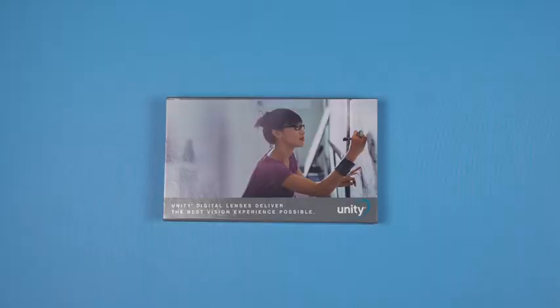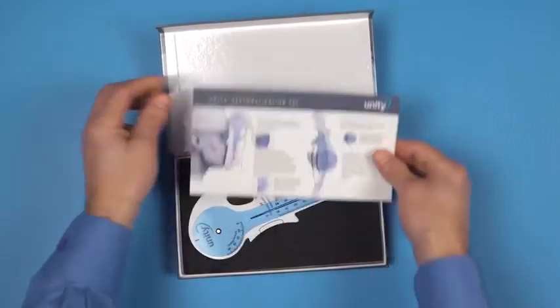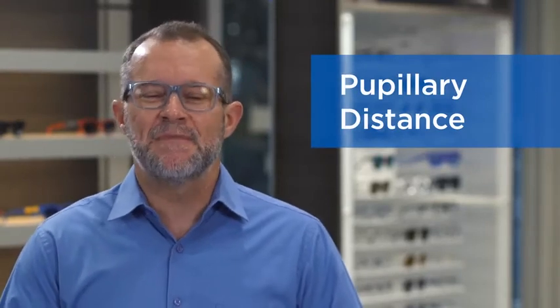Hi, we're here today to talk to you about how to use your Unity Personalization Key. This easy-to-use tool is what you'll use to take all your custom measurements. Okay, first we're going to take the Pupillary Distance measurement.